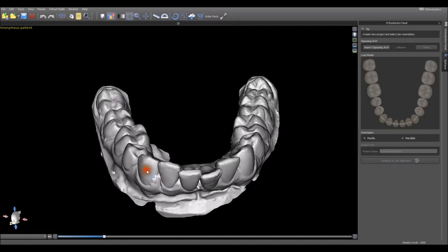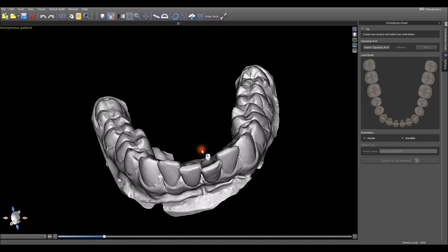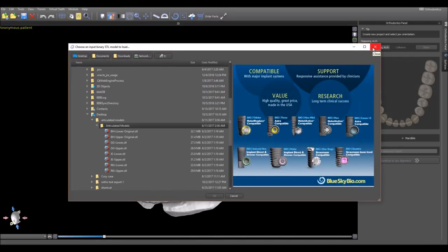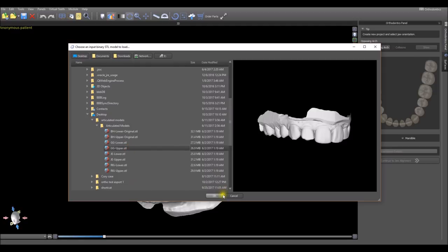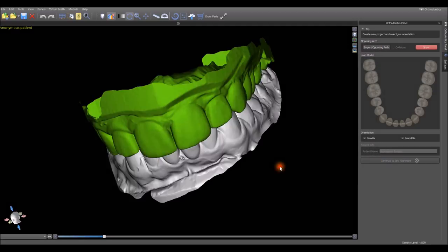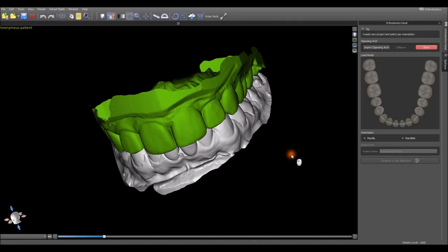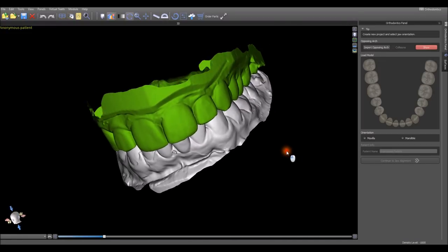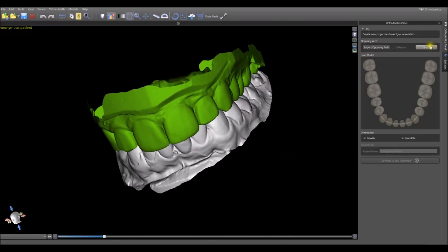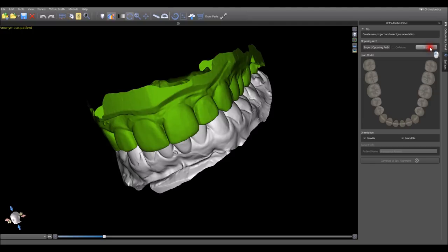We can go ahead right away and import the opposing arch by clicking the Import Opposing Arch button. Throughout the Ortho setup, we can hide or show the opposing arch by clicking the Show button.